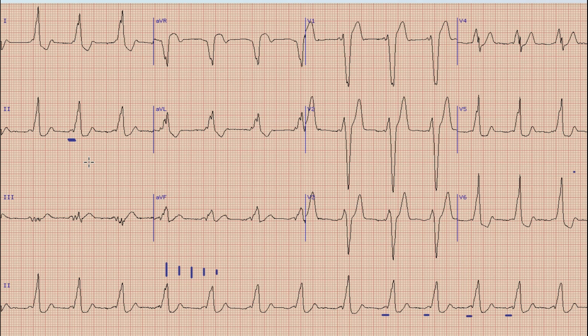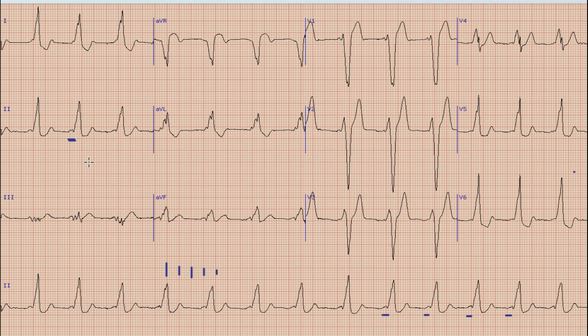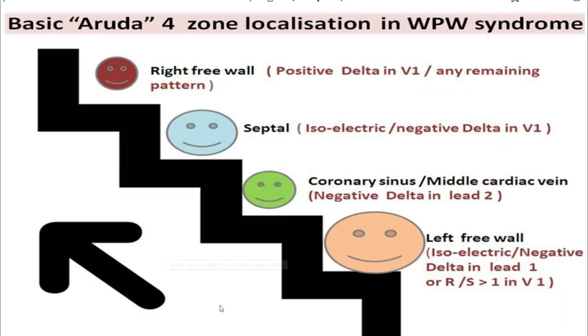Although the definitive method to diagnose the location of the accessory pathway is electrophysiological (EP) study, we can also detect the location of this pathway on the surface ECG. For that, we use criteria called the Arruda criteria. This is the Arruda criteria, which has 4 steps.